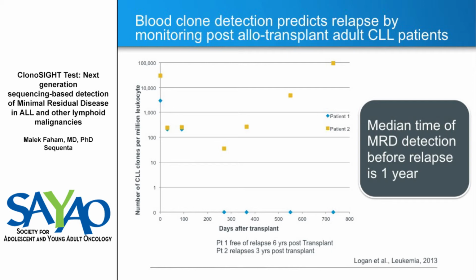On the other hand, the orange goes down in frequency to a pretty low level, now 30 per million, or basically less than 1 in 10,000, so about 1 in 30,000 essentially. It's pretty low level, but it's still not zero. At that point, the patient's level starts increasing until the patient relapses a little after here.